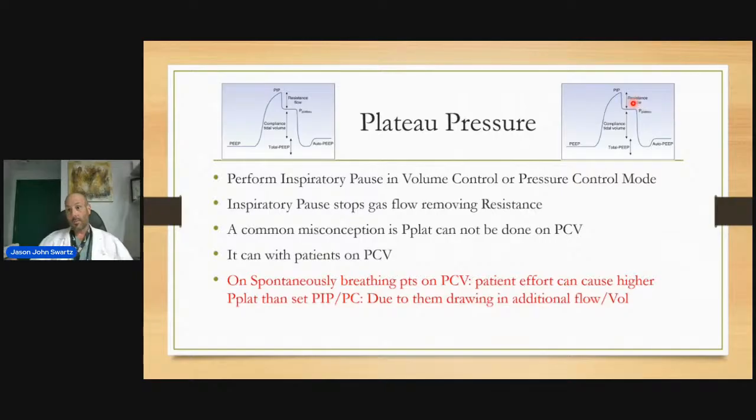There are a lot of articles discussing this in publication, and a lot of discussion on forums where people are having issues and thinking that when you set a peak inspiratory pressure, like we do on the V500, or set a delta above the PEEP, whatever that peak inspiratory pressure is, is the plateau.